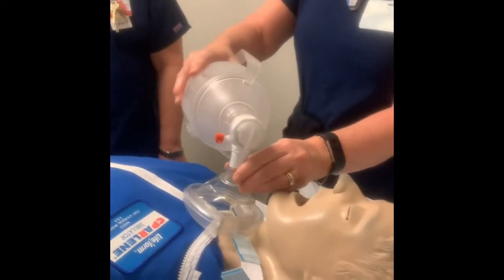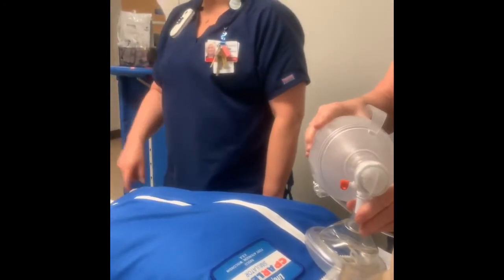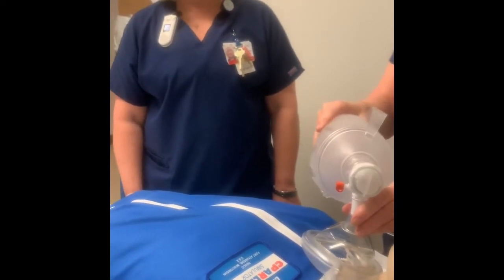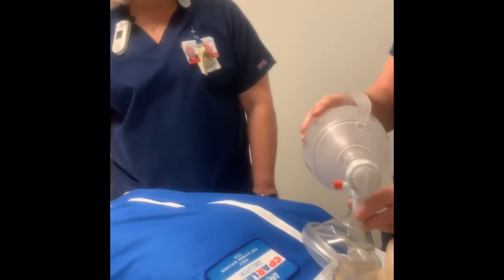And send somebody to get our doctor. Yeah, and you want to notify that physician and see if they'll come in and put it back in. So SWAT would be the first one to call. Yeah, call SWAT. Okay. Yep. They're certified to not do all of this. Some of them are certified, but none of those guys are certified at this point.